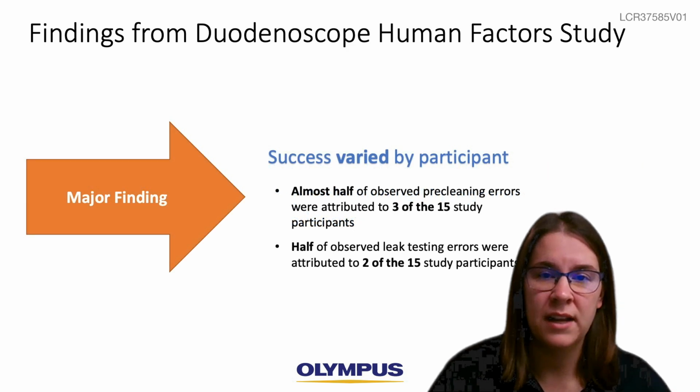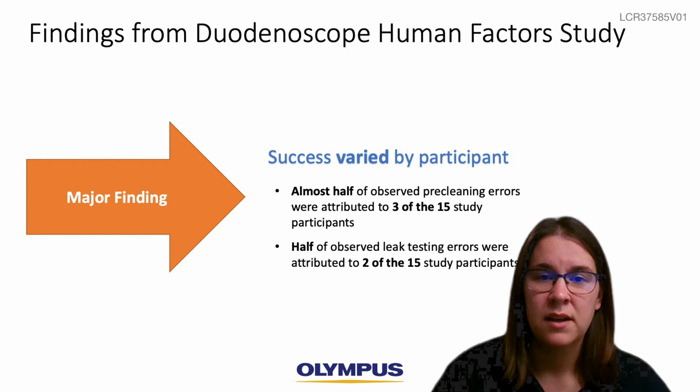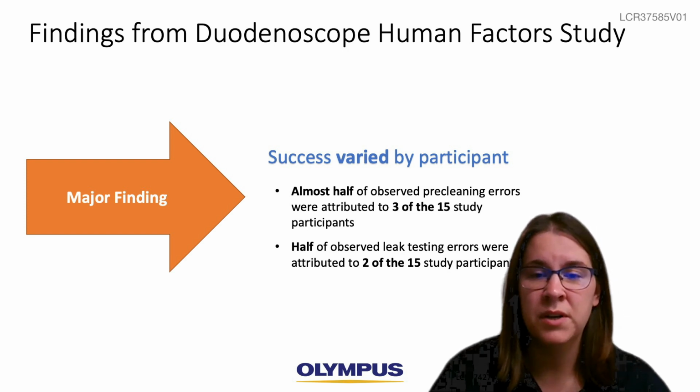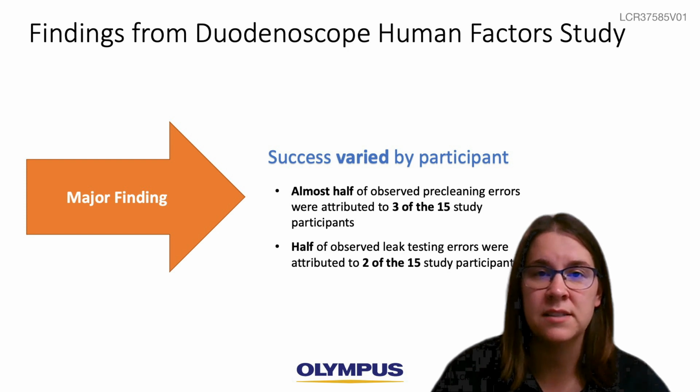The second major finding was that we found success varied by participant. Almost half of the observed pre-cleaning errors were attributed to only 3 of the 15 study participants, and half of the observed leak testing errors were attributed to only 2 of the 15 study participants.